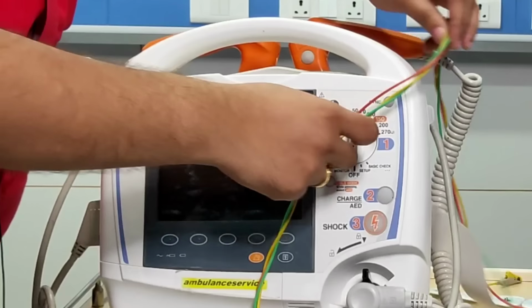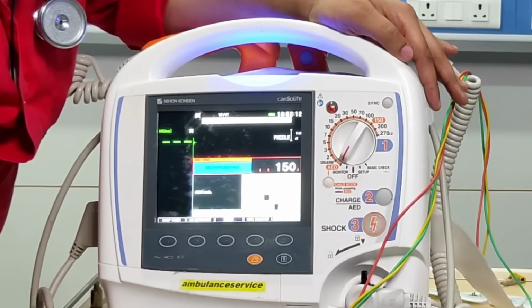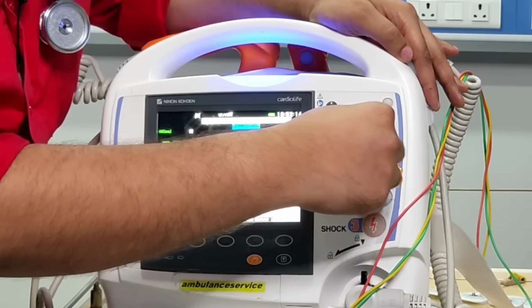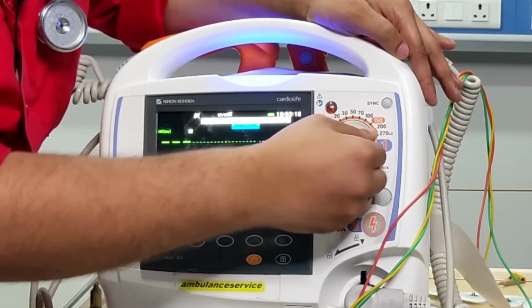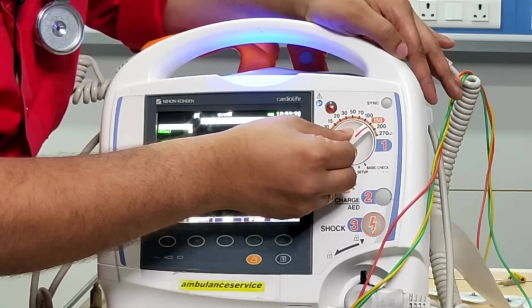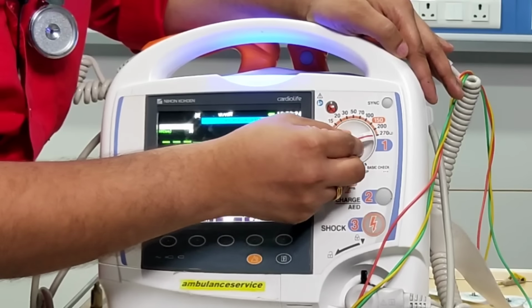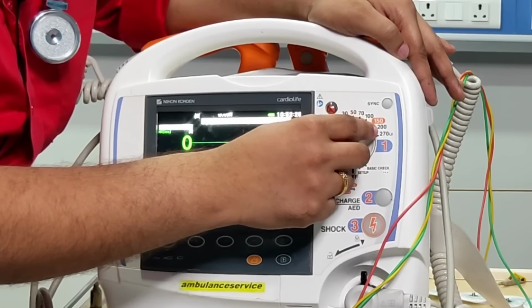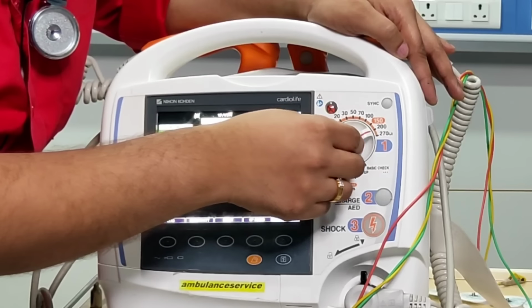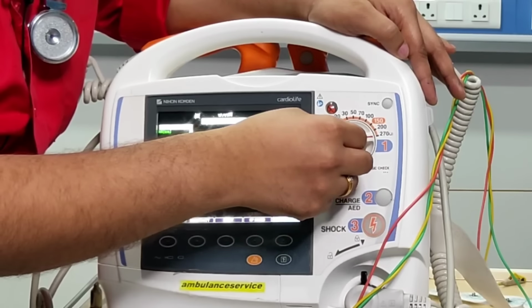And again you can see, I have switched on the machine. Adult mode. Use disposable pads. This is the AED mode that I have switched on. Now we can see I can select the energy. See here, I have selected 270 joules. That is the maximum, or you can start with your 200 joules. There is no harm. So 200 joules is the recommendation in a biphasic defibrillator, and if you are having any doubt, select the maximum joules, that is the 270 joules.